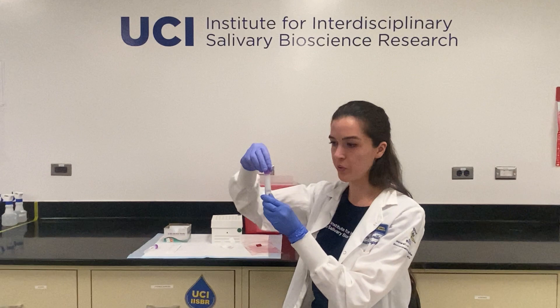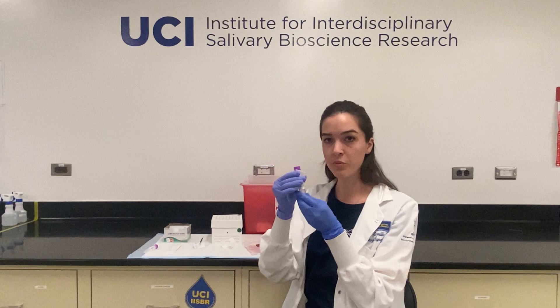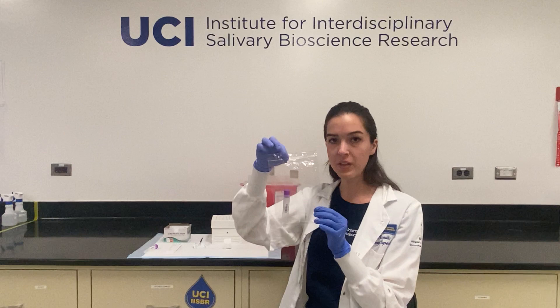At this point, you can recap your tube. You can take an alcohol swab and wipe down the outside of the tube to remove any saliva that might have spilled out. Take your tube and then place it either into your box or a plastic bag and immediately into the freezer. You'll then want to wash your hands thoroughly.